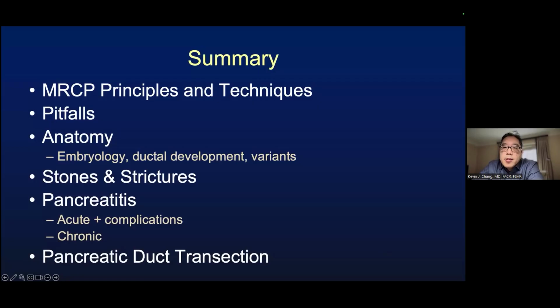And then the next question has to do with hepatocellular carcinoma, which is not relevant to this talk. And then the last question is the relevance of 4D flow MRI in assessing vessels of the pancreatic region.